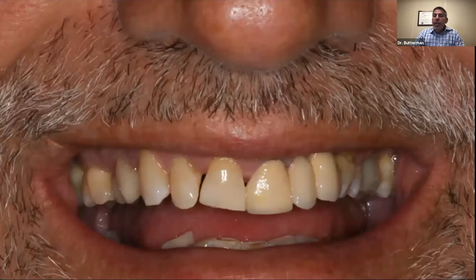So just a real quick case, because this was kind of new for me. Zirconia was a posterior restoration only. That's where it lived in my office, and it was great for molars, and I used it on first molars, second molars, but anything forward was always going to be Emax or a glass ceramic, because I just didn't feel like the aesthetics were there. I've got to say, Katana is kind of changing that a little bit for me. Now, in full honesty, when I do use it for anterior restorations, when I come premolar forward, I normally also do put a little bit of stain and glaze. I don't feel like just a polished restoration is going to be enough.